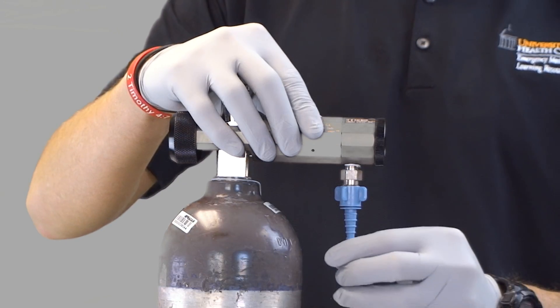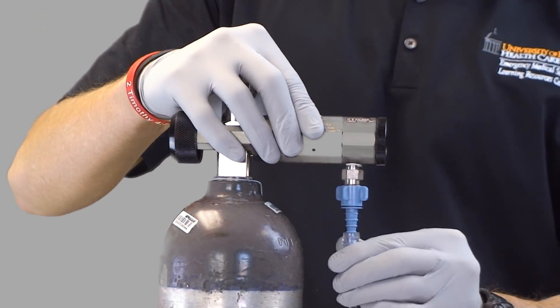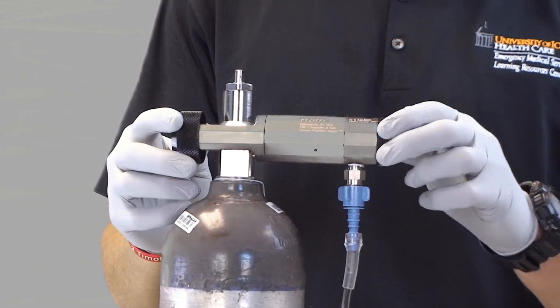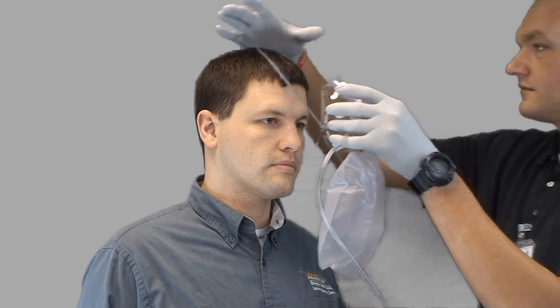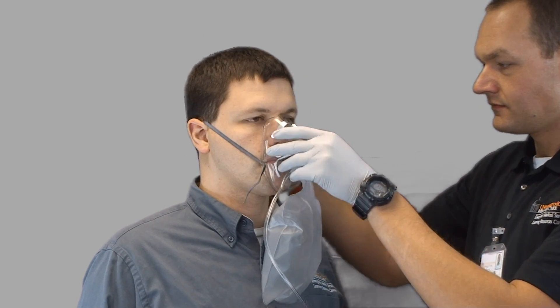I will check my non-rebreather packaging for any tears, punctures, or missing pieces. I will then attach the oxygen tubing to the port on the regulator and set the regulator to deliver between 10 and 15 liters per minute. I will place my finger over the one-way valve on the reservoir bag to allow it to fill. After the reservoir bag is fully inflated, I will place the mask on the patient's face and tighten the straps around the patient's head.